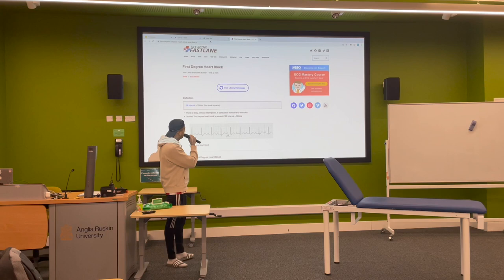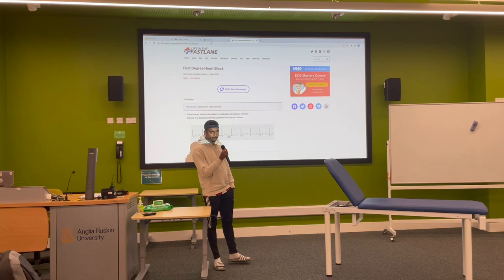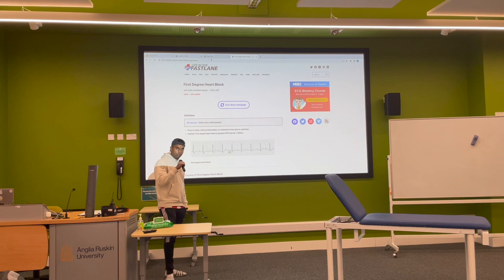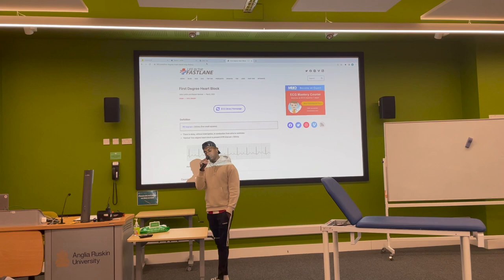So, what does an ECG show? In general, the heart. What specifically about the heart? Rate and rhythm, yeah. What else? Electrocardiogram. A gram meaning a picture, a snapshot. It shows the electrical energy of the heart, the electrical impulse and the electrical conductivity of the heart, correct.